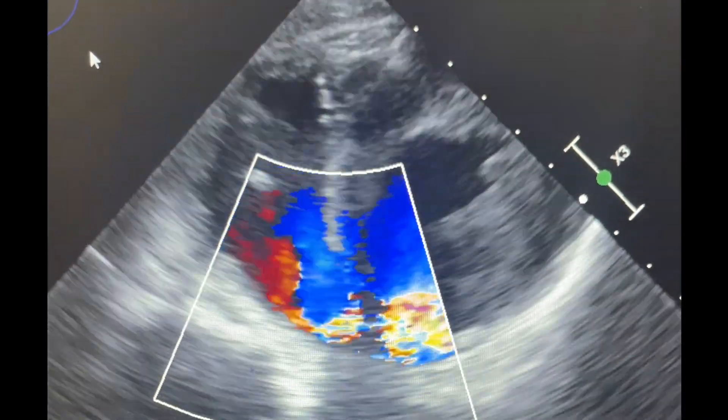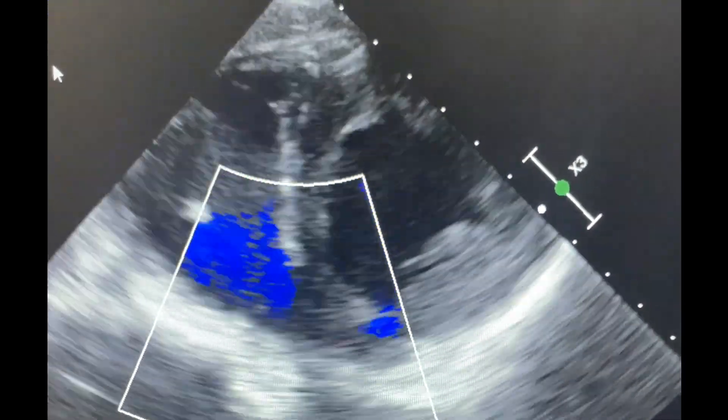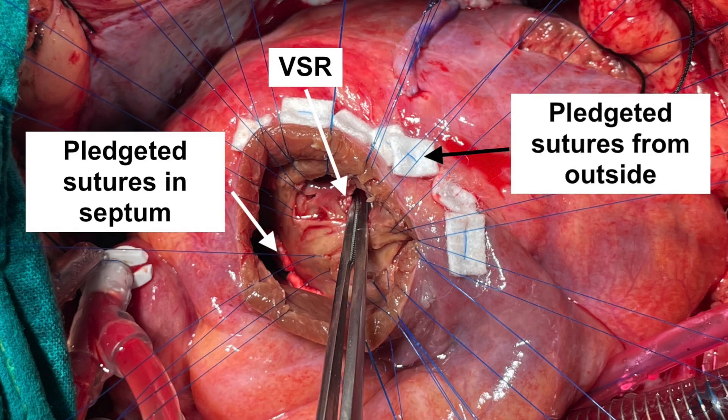This is another case where the VSR — ventricular septal rupture — appeared apical on echo. However, the defect could not be found after the LV ventriculotomy. The RA was then opened and the defect could be seen far away in the RVOT. The RVOT was then opened. Here you can see the opened RVOT with a PA catheter in place and a suction catheter being passed through the defect, coming out through the left ventricle as seen in the top right corner of this picture. The defect was closed in a similar fashion as described above and a couple of sutures were also taken from outside.